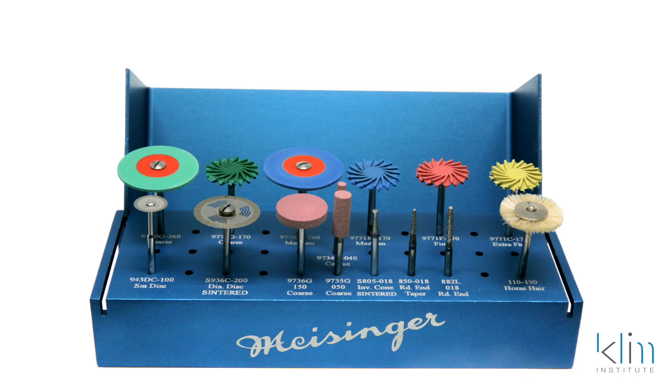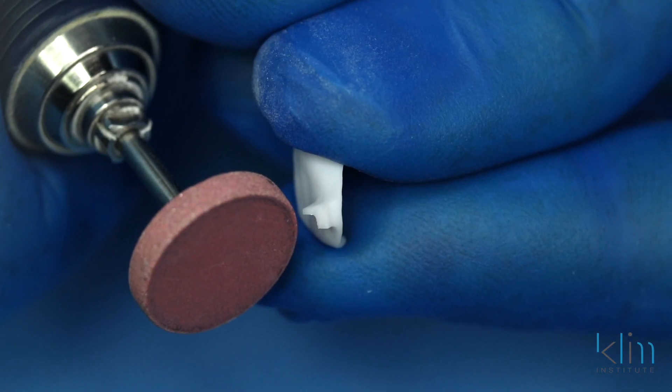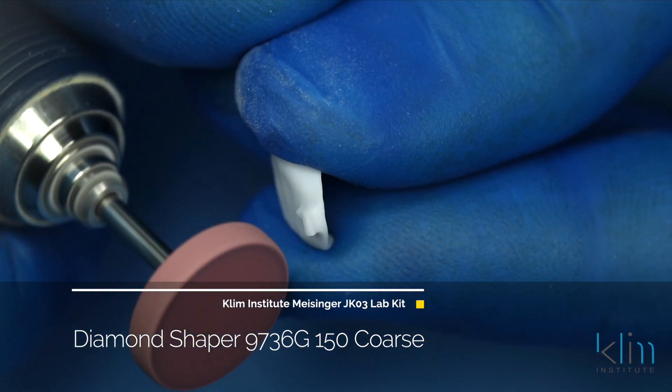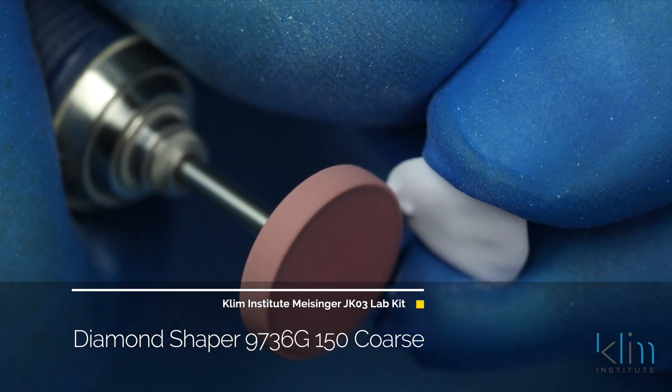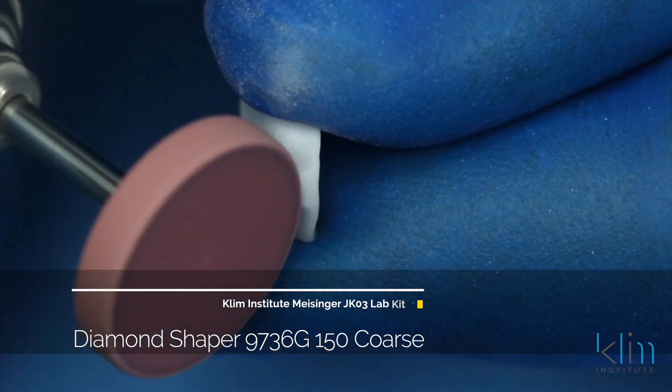When removing the sprue, I prefer the shaping diamonds — there's a wheel, cylinder, and taper. I like the wheel. Make sure the wheel is spinning away from the margin and use light pressure. This wheel is designed to not hurt the ceramic; it's very tender for e.max and it won't overheat it. Remove that sprue and stay away from that margin so you don't chip the margin.